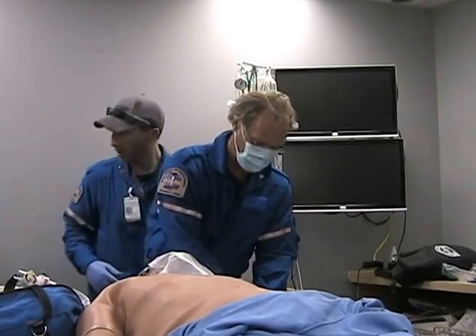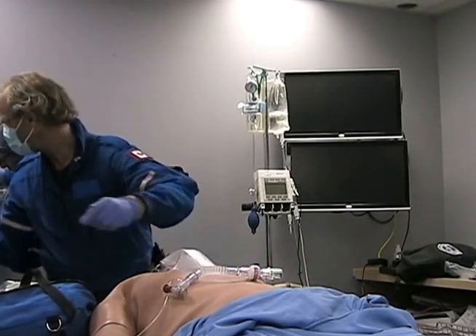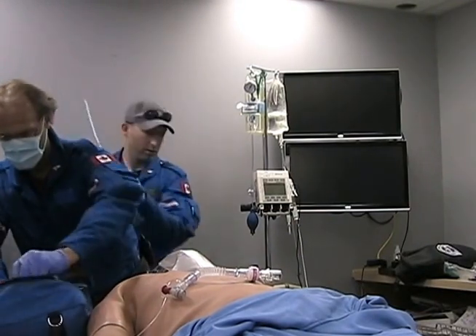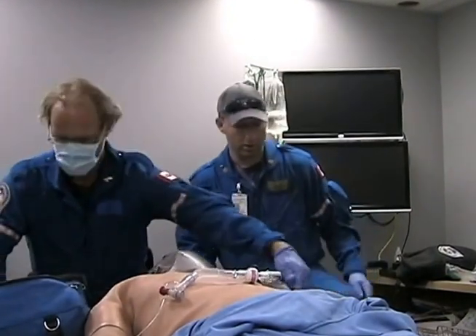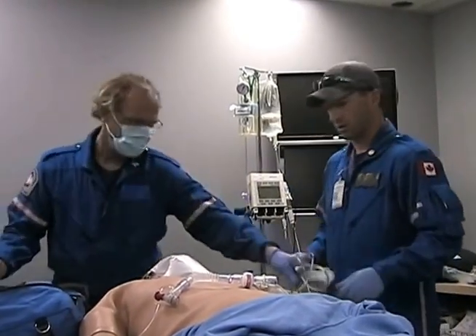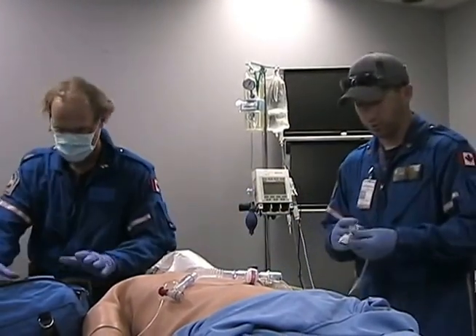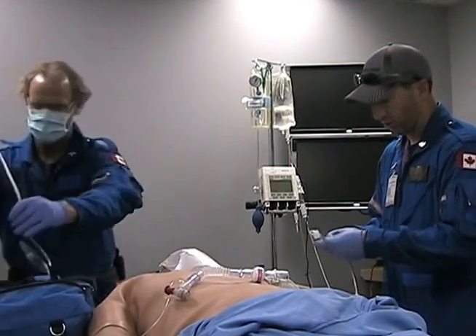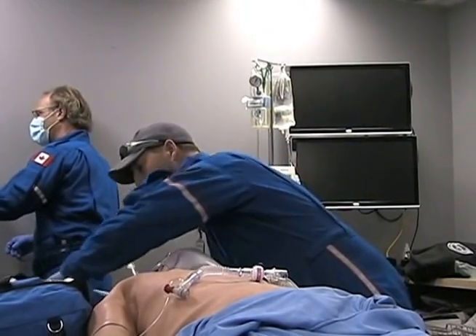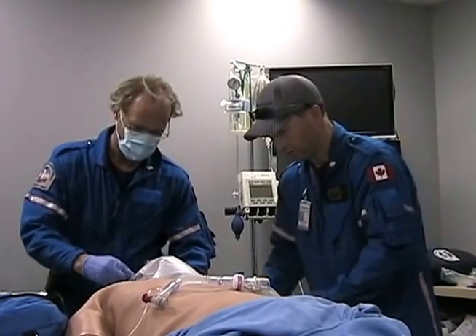Okay, good. Just turned on his non-rebreather there. Can you get the bougie there for me too, just because you're right there? I sure can. She's there, thank you. Do you want me to throw some nasal prongs on this guy as well? Yeah, that would be great, actually it's in behind me. If you want to actually test the cuff, that would be great. I'd love to. Just so we're not crossing over one another. Great. And I'll just loop that tube up for you. Okay, it's all lubed. Thank you.